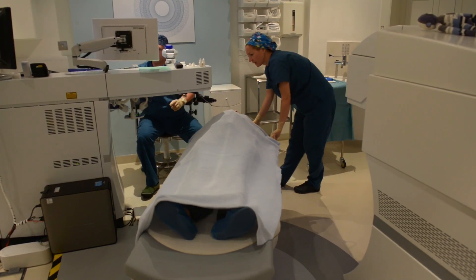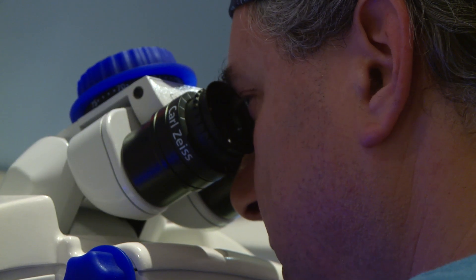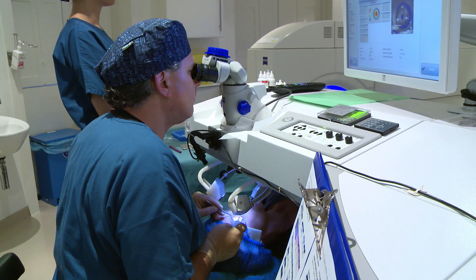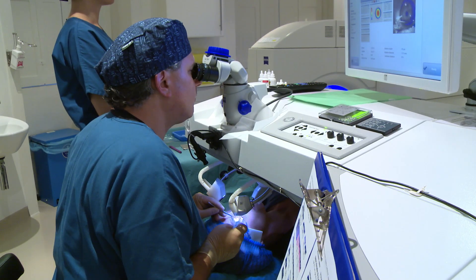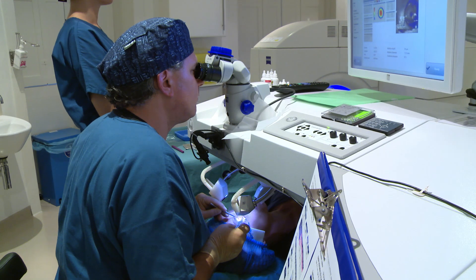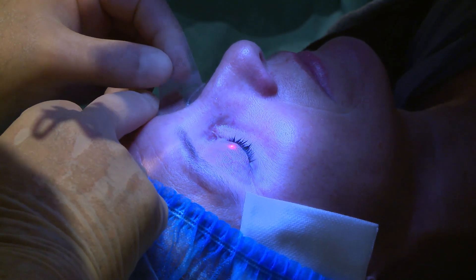The second type of procedure we offer is RELAX Smile. Here we only use a femtosecond laser — we don't need the excimer laser. The femtosecond laser creates two planes, two interfaces, within the middle of the cornea. Using the bubble distribution, we're able to, through a tiny two-millimeter surface opening, dissect through those bubbles, loosen the little lenticle, and remove it through the opening. The big advantage RELAX Smile has over conventional LASIK is that there's no flap, giving more biomechanical strength to the cornea, and we're not interrupting many of the nerve fibers on the surface, which potentially means less dry eye in the early post-operative period.